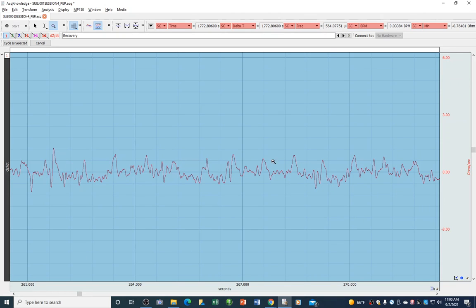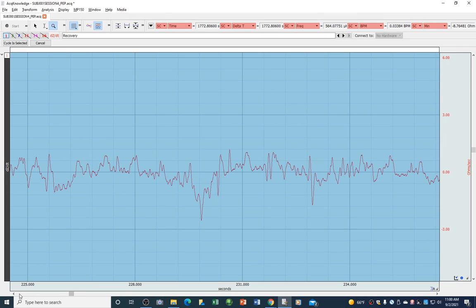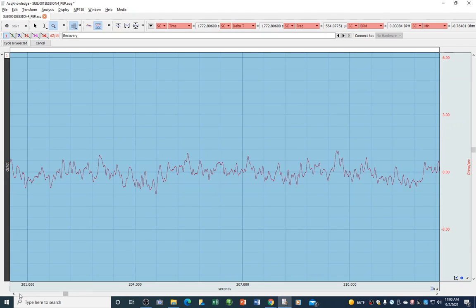So if you see anything like this, where you just can't see any pattern whatsoever from one scroll to the next, come talk to me and we'll probably declare it a dead data set.